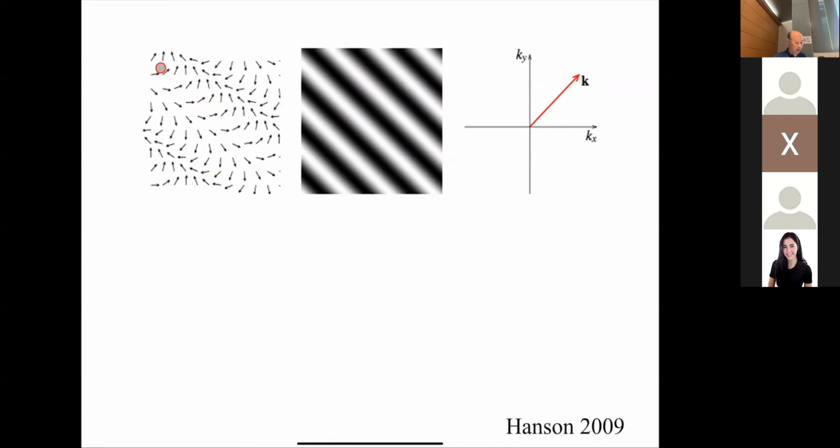And so you can see the pattern here. All these spins have the same phase along the diagonal lines, okay? So now in the spin domain, these stripes correspond to this: if you look down any one stripe, those spins will all have the same phase, all right? And so you're imposing spatial patterns of variation, so that if you go along any diagonal here, you're showing the spins are varying along this line here, okay?